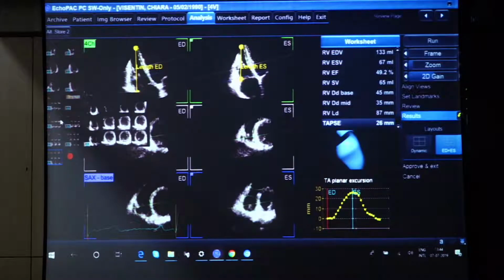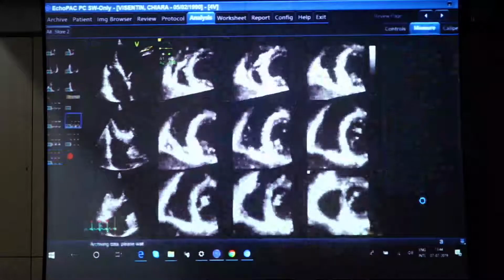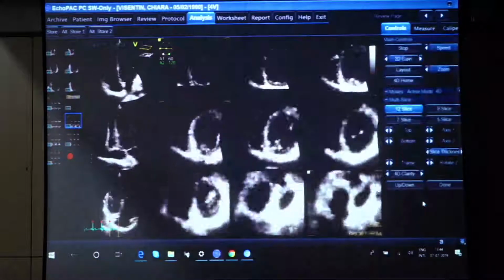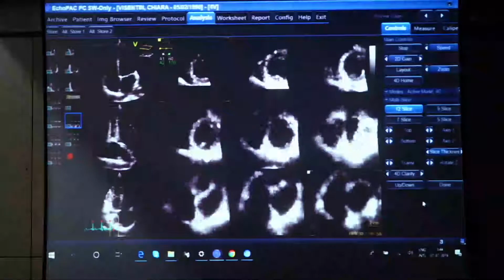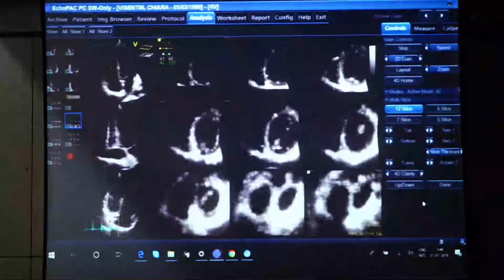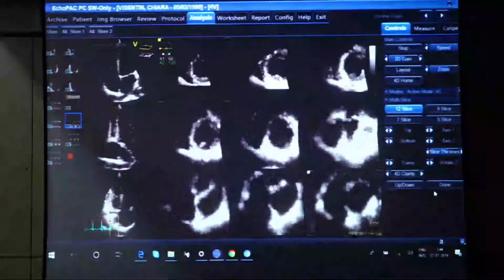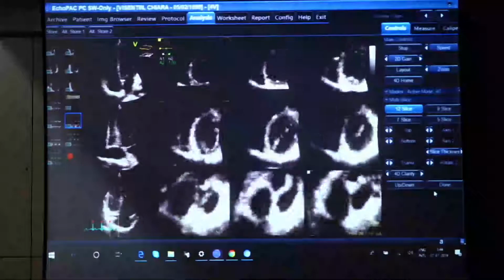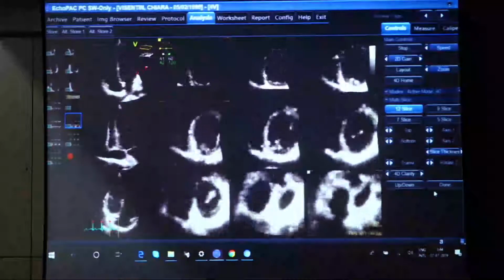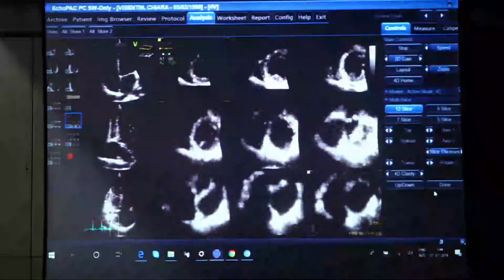So for the left atrium, we need number 52, I would say, where we have a data set including both atria. And again, to compensate for the increasing depth, we have reduced the size of the data set.